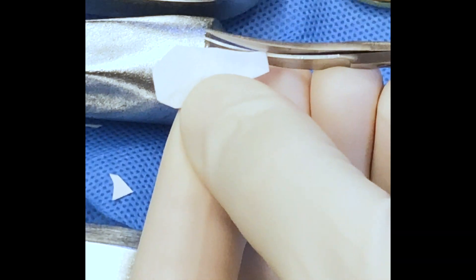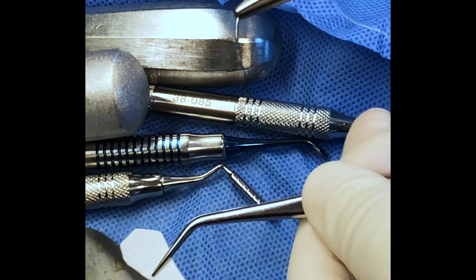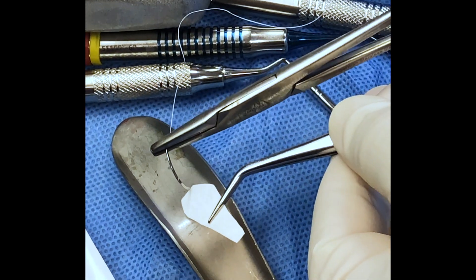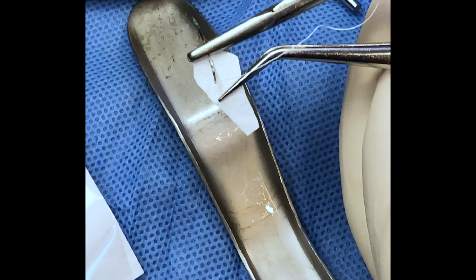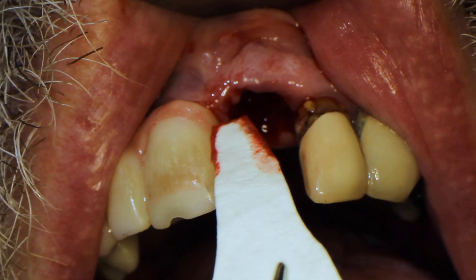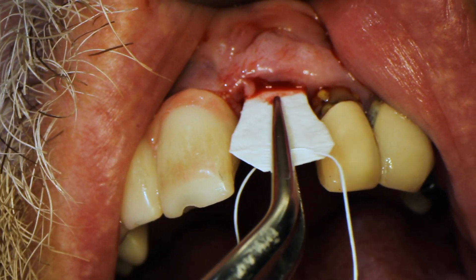Before the membrane gets wet, it's really easy to manipulate — it's got the consistency of construction paper, so I like to do all my manipulation before it gets wet. At the same time, I'm running a suture through the bigger portion of the membrane. Putting the suture in now makes it a lot easier so I don't accidentally push the membrane out of the way once it's in the mouth.